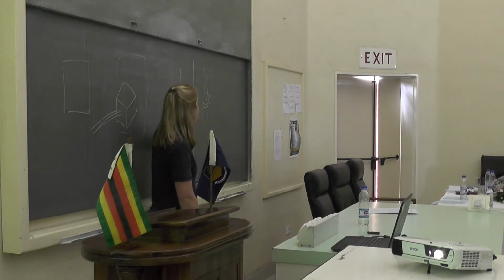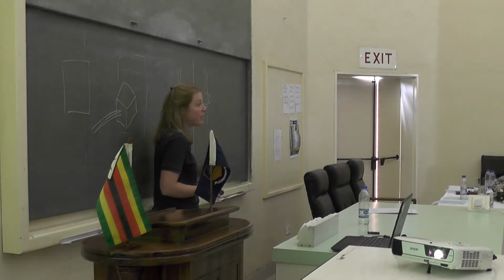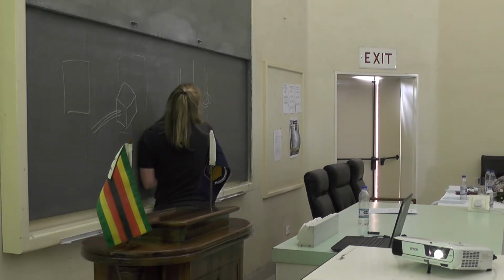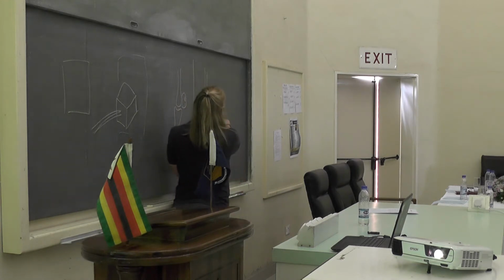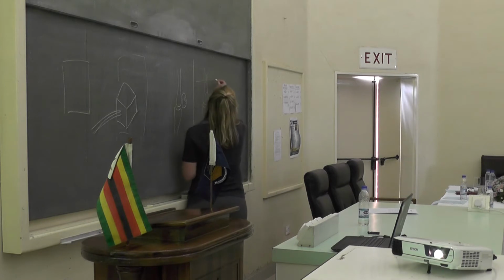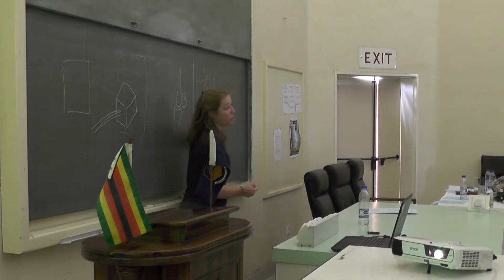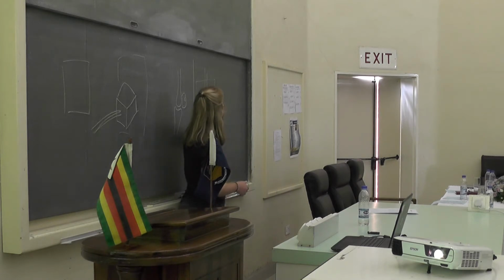I essentially see a nice sesamoid bone, but what this represents is the two sesamoid bones overimposed on each other. So what if my fracture or my problem was actually on this lower one, and it's a little thing here that's just going to be overimposed by the one that's in front of it? How can I highlight that? That's why it's important if you rotate it in such a way that when you have the cassette behind it and you project the whole image, you can hide one sesamoid away behind it, so it doesn't matter, I'm looking at this one now, but this one gets completely free of overimposition, which allows me to objectively assess the whole margins of this.